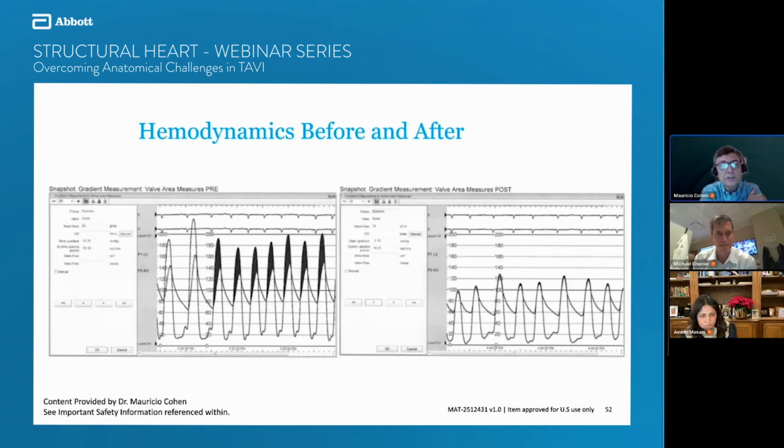Here you can see that we corrected the aortic stenosis. And what I was telling you about the separation between the diastolic aortic pressure and the LVEDP here is good. The AI index, we used to calculate that in every case many years ago. We don't do it anymore, but we do look at that gap between the diastolic aortic pressure and the LVEDP, and when you see that separation, that's always reassuring. Echo, hemodynamics, and gradients, everything looked good, and we let our vascular surgeon complete the case.